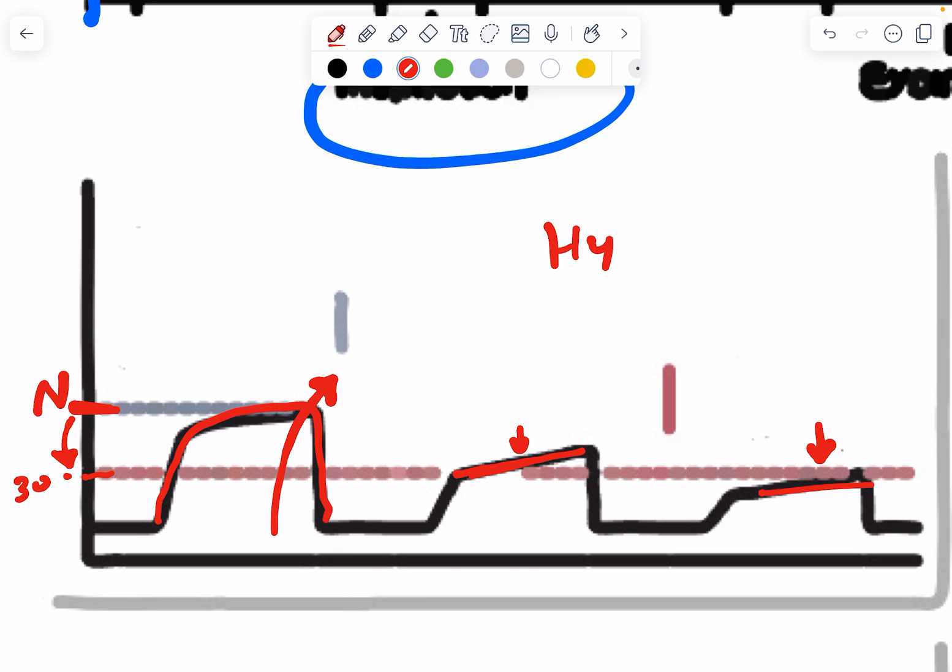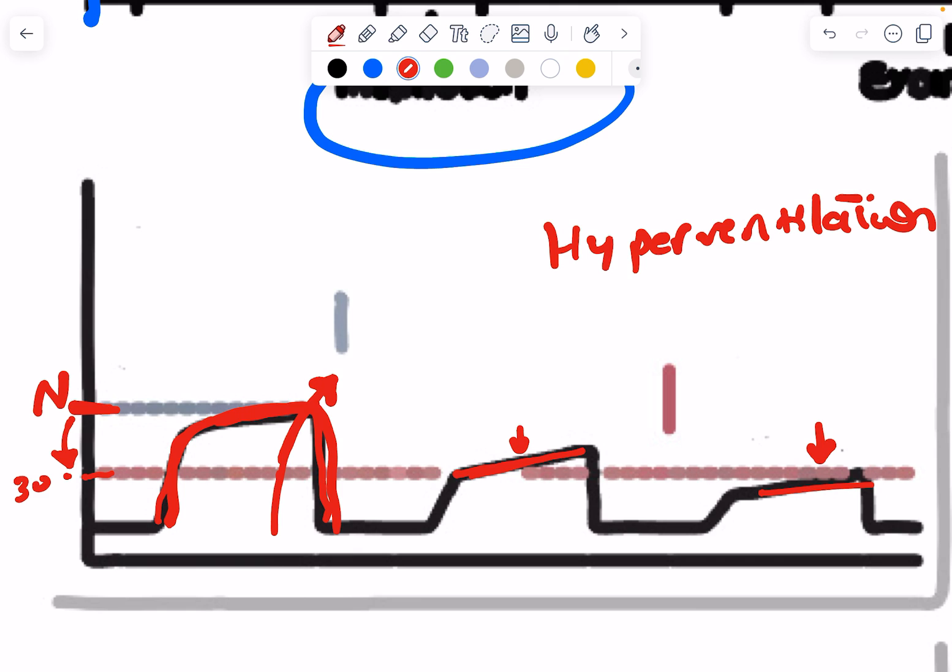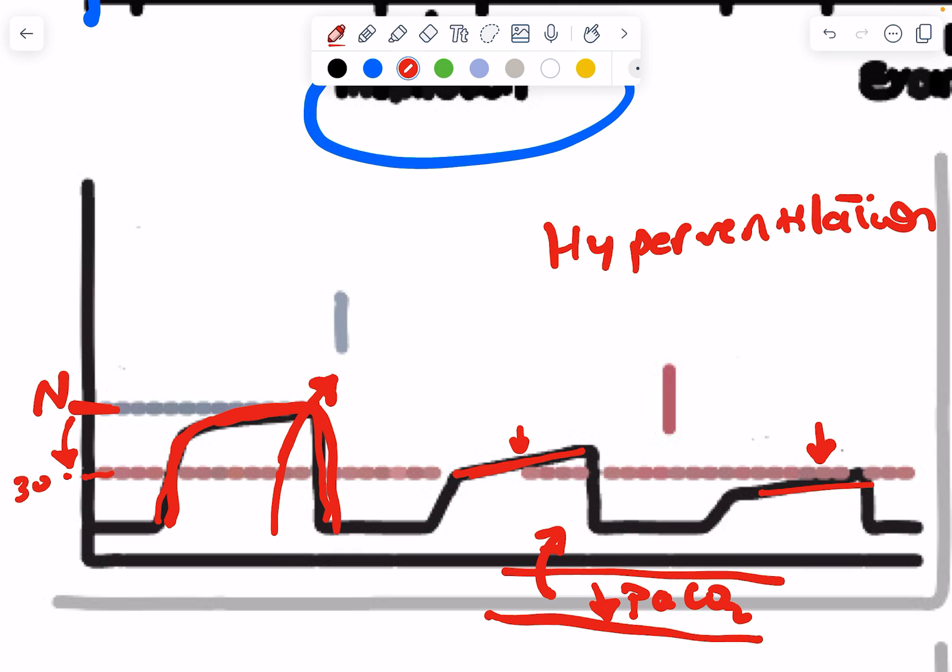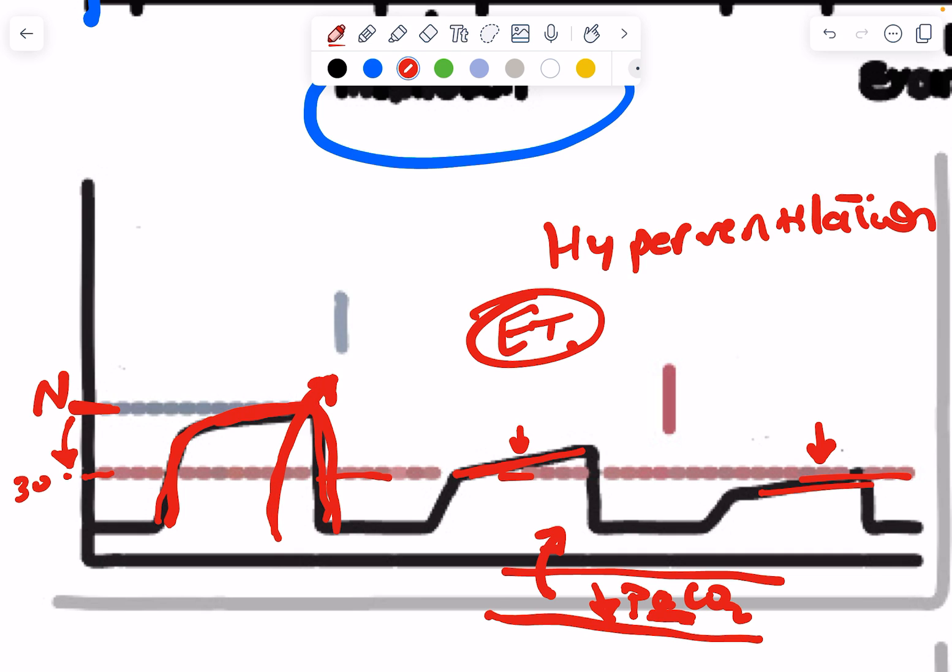Initially, this was detected as a lot of CO2 being detected by the end tidal CO2 detector. But then later, as he keeps hyperventilating and getting rid of so much CO2, the carbon dioxide in his blood, the PaCO2, is getting lower. And therefore, the carbon dioxide that he's exhaling is also lower. And so this lowers the baseline, because end tidal CO2 is a reflection of PaCO2. But initially, it was high because he was hyperventilating, washing out so much CO2 detected by the detector until he runs out of it. And so the baseline goes down.